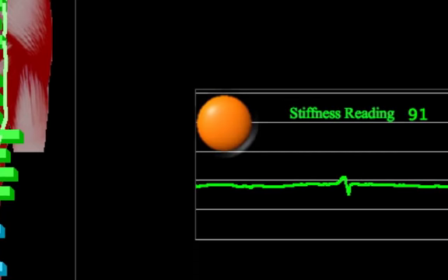We also have a preload indicator in the adjust area that lets you know how much force you're pressing with the adjustment. T1. This way we keep a consistent adjustment between different doctors in the office, or for newer doctors to see the consistency of their adjustment.